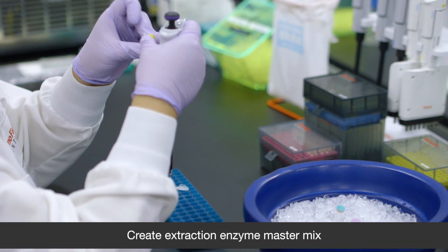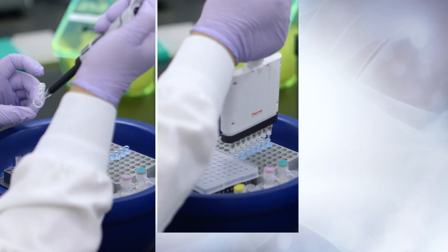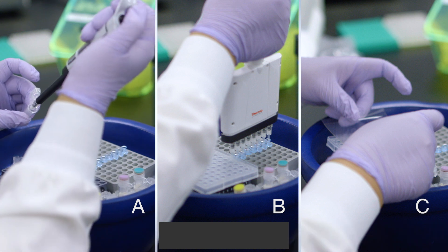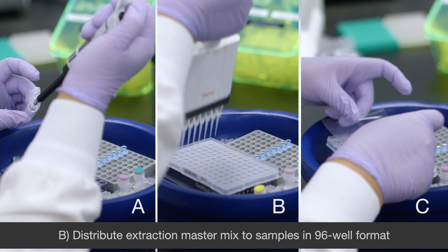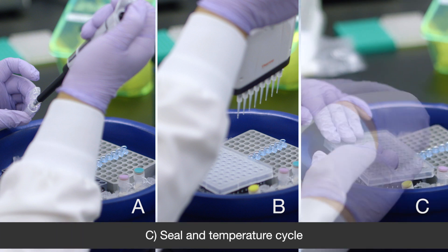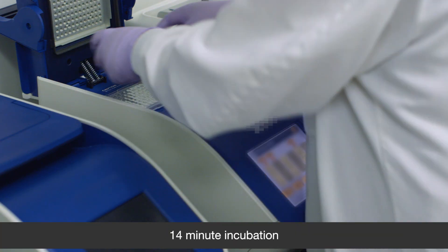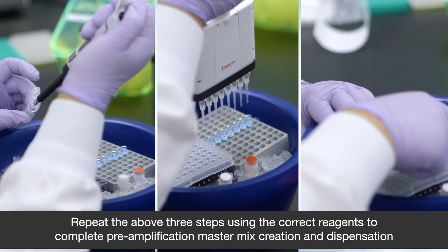First, you extract the GDNA starting from just 1 to 10 cells. And following a short 14-minute incubation in the thermocycler, the samples are pre-amplified.